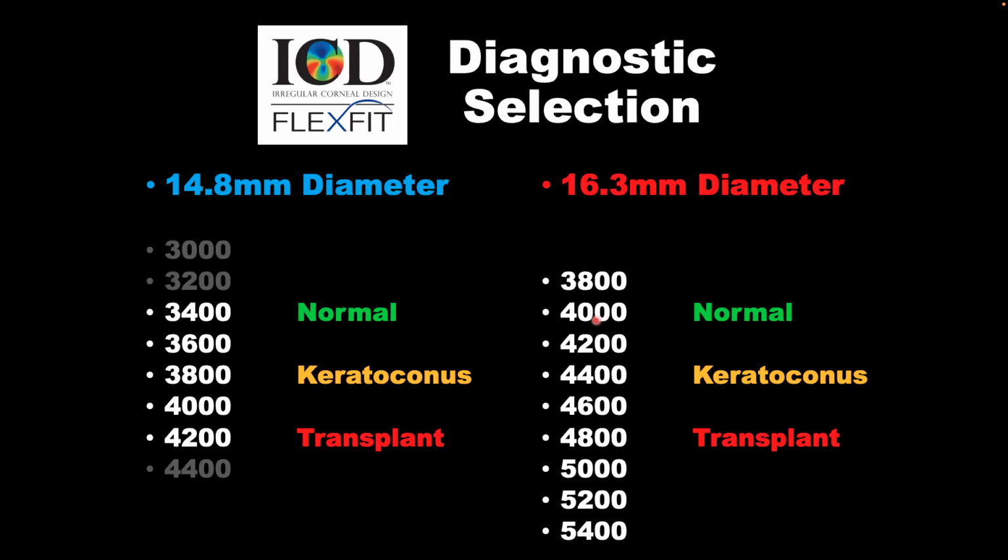So I would strongly suggest just to change the lens and just see it with your own eyes. Whenever you are more experienced and the learning curve is past, you can just make the modification as you go. But if you're starting with the ICD Flex, I will suggest to change the lens, drop it down, or go up and see what it looks like, right?